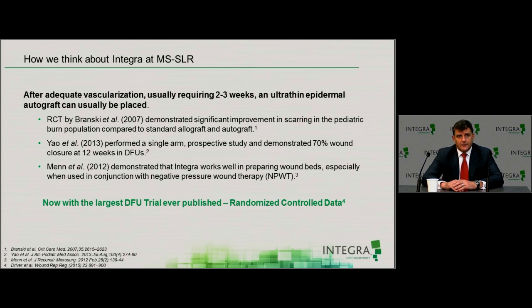What we fundamentally do, again, is a protocol. Bransky, Yao, and Men have all put this into nice criteria, and what they really looked at is well debrided, appropriately prepared wounds treated with IDRT, often in conjunction with negative pressure wound therapy. The silicone is usually lost or removed at 14 to 21 days. Potentially another week goes by before they're skin grafted, at about 4 weeks post-application.